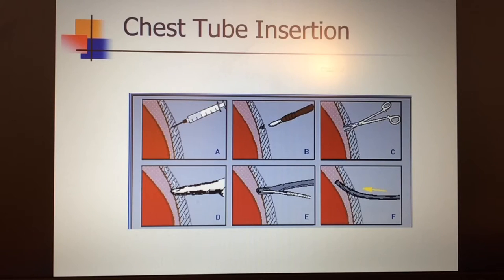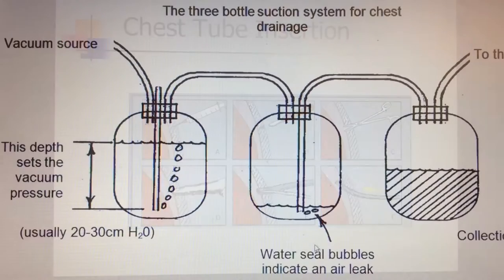The physician will do a series of techniques to place the chest tube, including anesthetizing the site, making a 2 to 3 centimeter laceration to the area, inserting their hemostats, opening up the tissue and expanding it, inserting their finger, making sure there are no blockages in the way of the chest tube, inserting the chest tube, and making sure that all the fenestrated holes reside within the pleural cavity. The chest tube usually remains in place until the x-ray shows that all the blood, fluid, or air has drained from the chest and that the lung is fully expanded.